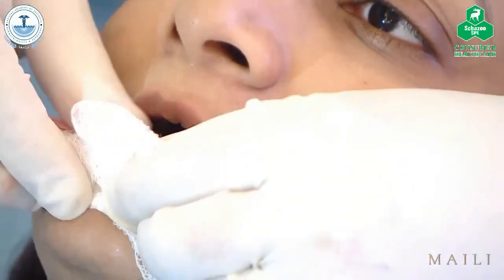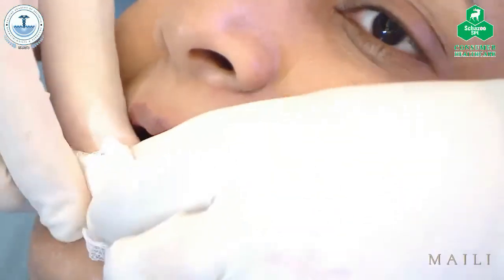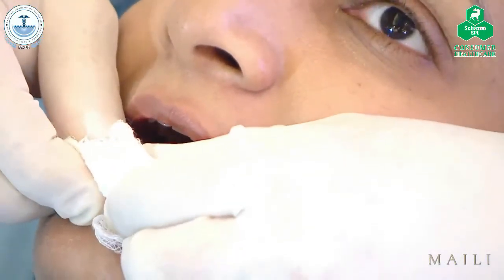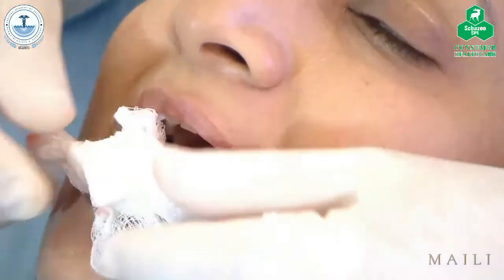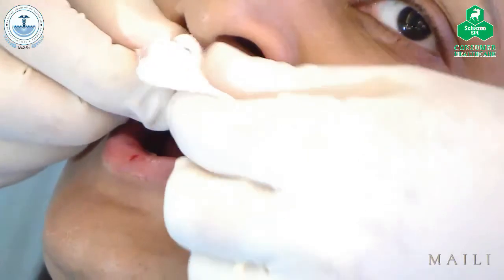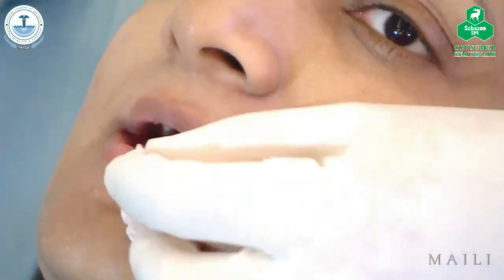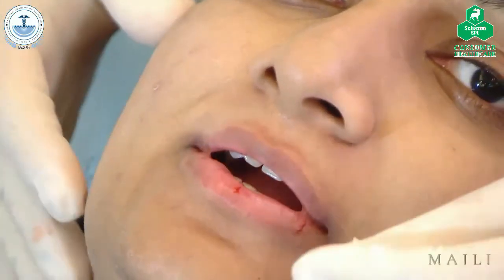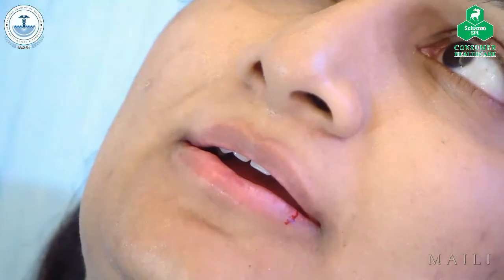And just massage. How are you? Bearable? Don't be so harsh, as Rami said. You can create a bruise. Oh no, I do. Hematoma. I'm more aggressive with my fingers than with the needle. Okay. After how many days do you recommend touch-up for the lips? Can you look there? Very natural. What a great job. That's it. Brilliant. Let me give you a mirror.